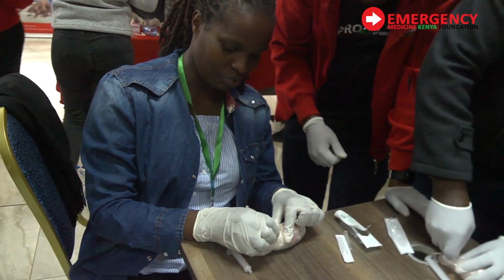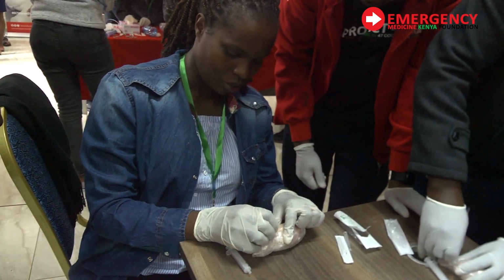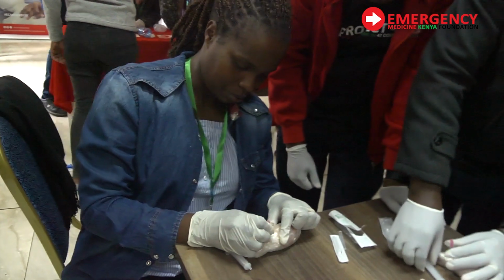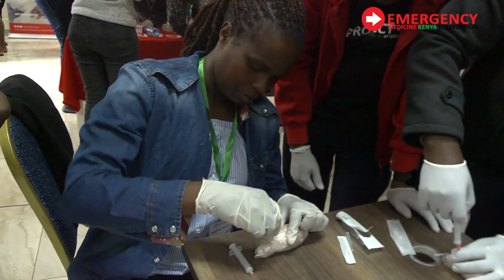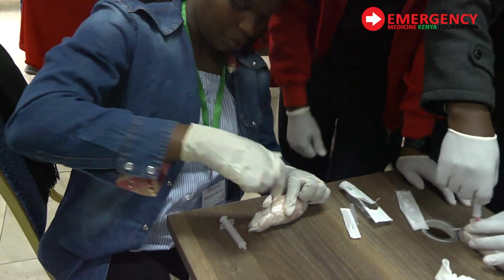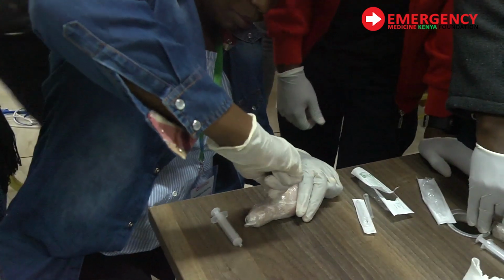Try again, somewhere else. Locate somewhere else and try. You can still do around there, just locate somewhere else. So you do that, then put your finger. See this part of the finger, this part on top here? Yeah. This gives you the force on top.